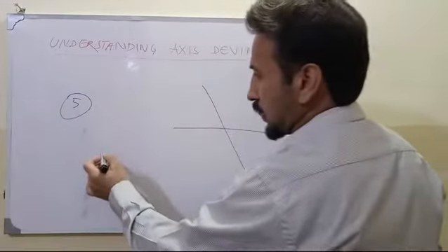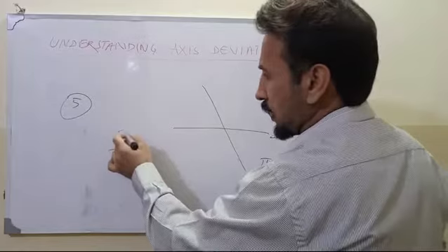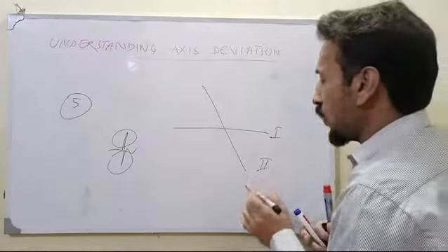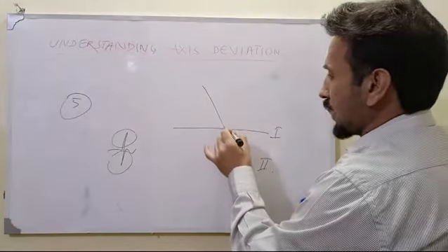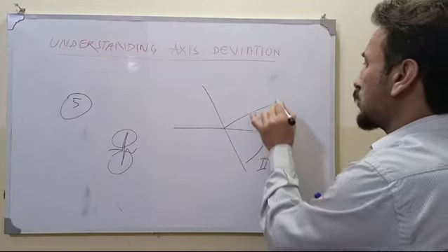For example, if the QRS complex in lead 2, the upward and downward deflection, the R and the S wave, are of similar amplitude, this means that the vector is lying at 90 angle away from lead 2, right? And the vector which is making a 90 angle to lead 2 is AVL.